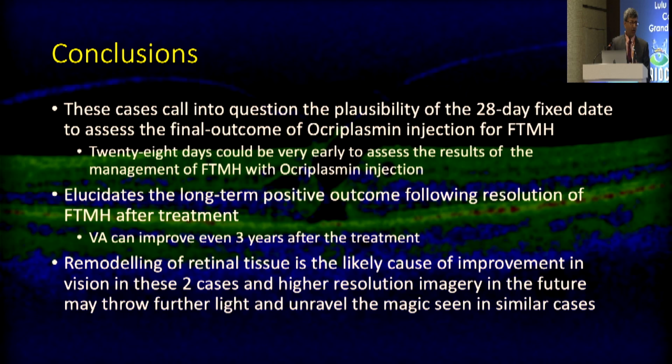Some kind of remodeling is taking place within the retina, and therefore we really need some higher resolution imagery, which may be available in the future, which can throw further light to unravel the magic seen in similar cases.